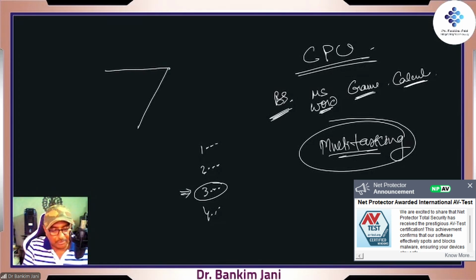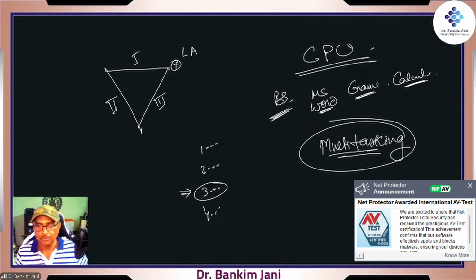The leads are 3 only, right? This is 1, that's 2, this is 3. Leads are 3 only, but detecting from this point, that means this is the left arm, so it will detect from the left arm. At that point, it will make this pole negative, this is positive. Then immediately it will flip. That flip is so fast that you will find that all the graphs are going together. So that's the power of processors.